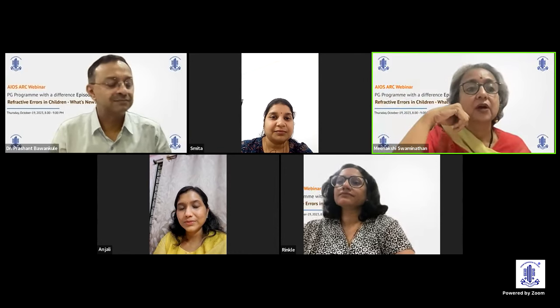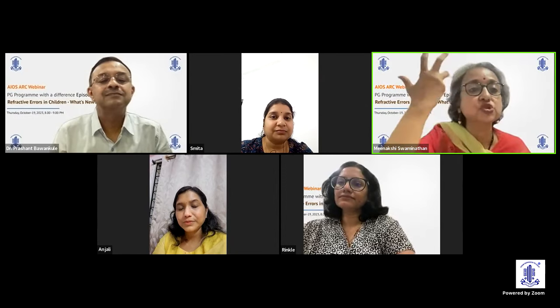So the thing about DIMS or any of those glasses is the cost is prohibitive. And the second thing is, even though the company says they will replace one for free, the other issue is the positioning of the glasses. Younger kids tend to wear them in crazy ways. If not properly positioned, they won't work at all. Also, they came much later to the market, and so most of us are comfortable with low dose atropine as the first line of treatment.